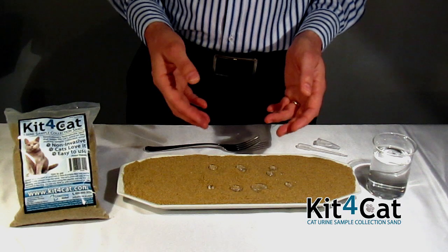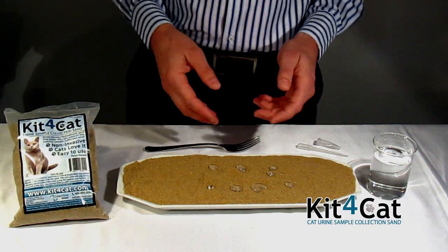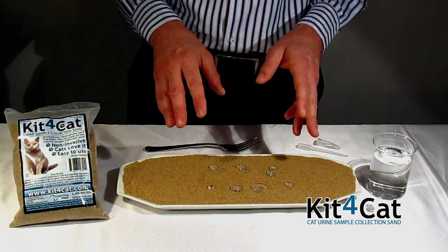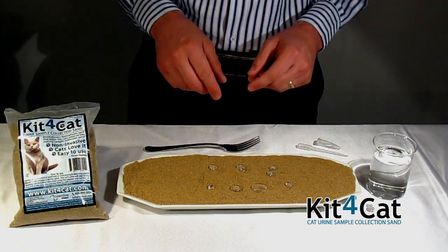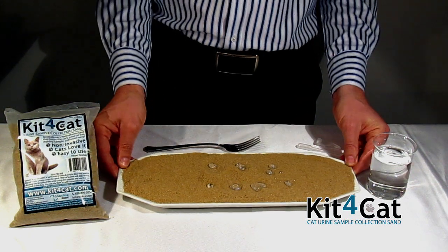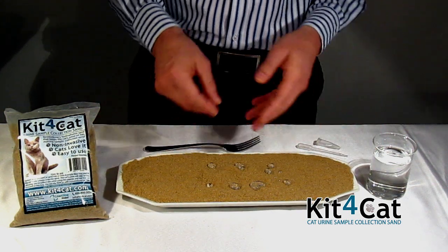Another great property of Kit4Cat is that it is non-toxic, so even if the cat licks its paws after touching the Kit4Cat sand, nothing will happen. Another nice feature is that the sand is completely biodegradable, so when you're done with your test, you can just dispose of it in a regular trash can.